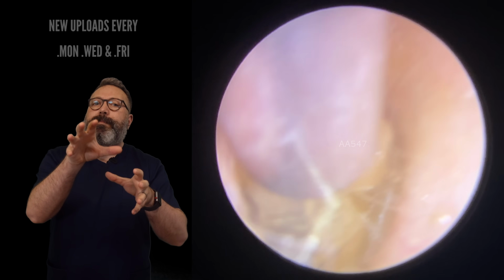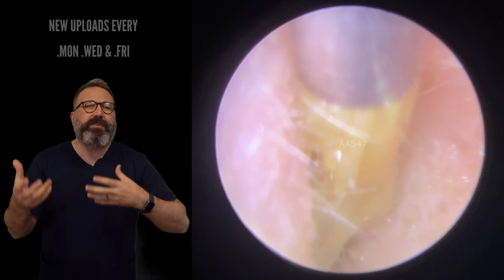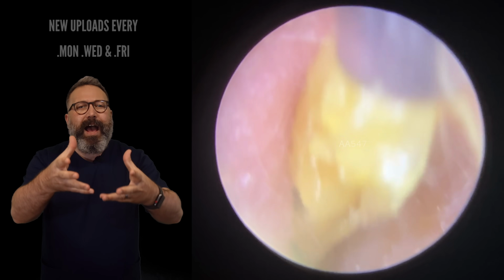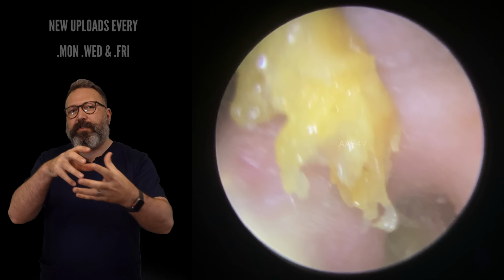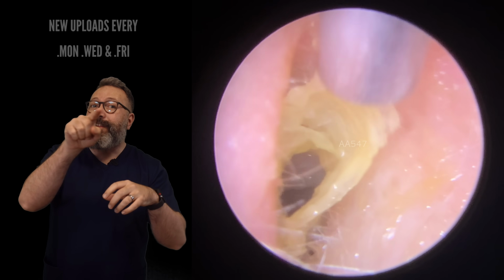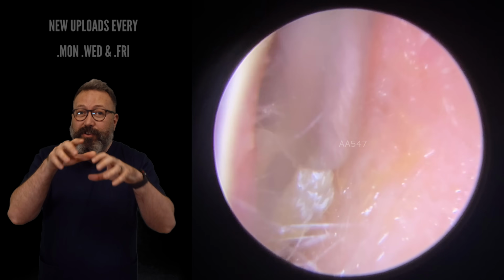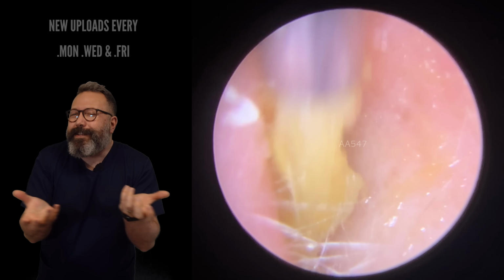Look what happens when we pull this first section away. So this section is very soft skin. Patient's been using some olive oil to soften this up. As this comes away, you can see, there we are, it's trailed off, it's pulled the neck section forwards. Look at the neck section, how this forms a sleeve. There we are. You can actually see how that's the ear canal, the surface layer of the ear canal wall skin all come away. Why does this happen?